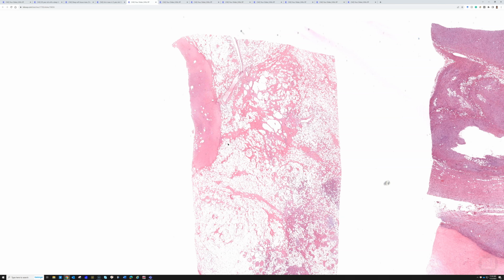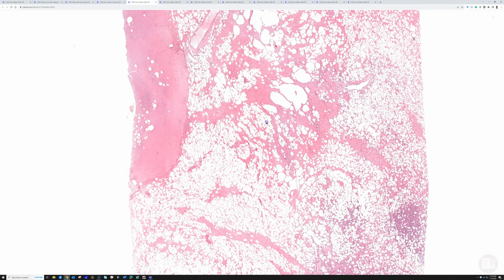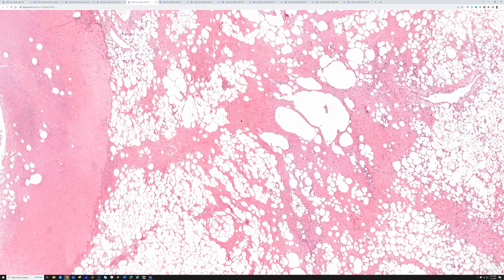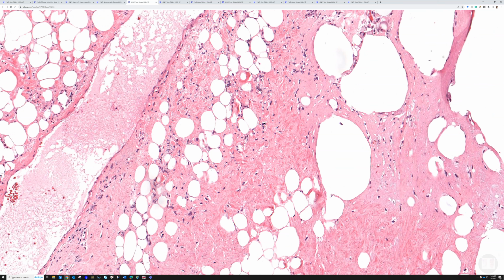If this were a well-differentiated liposarcoma in the extremities, we would call it atypical lipomatous tumor. It's the same tumor, we just give it a different name when it's in the extremities because it has a better prognosis there. But the three things I like to see are mature fat, usually with variable size, large, medium, and small adipocytes, fibrous bands in between, usually dense, hyalinized, sclerotic collagen, and then scattered hyperchromatic atypical cells. And all of those components can vary, and not every case has all of them.